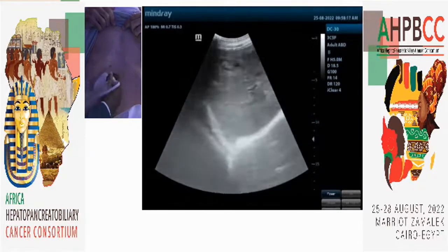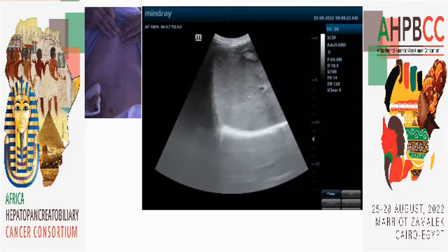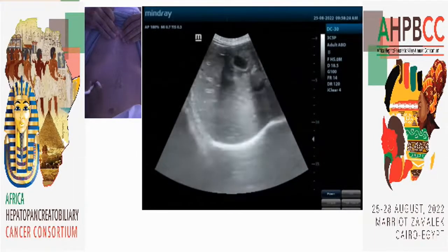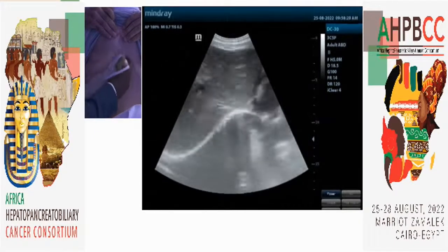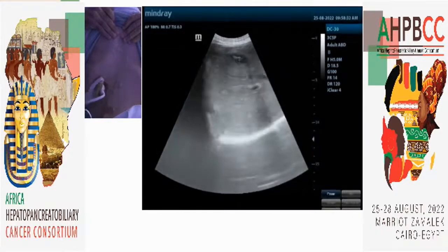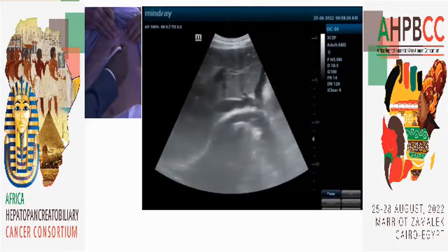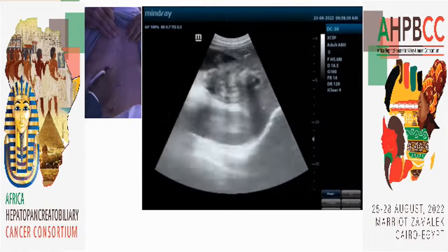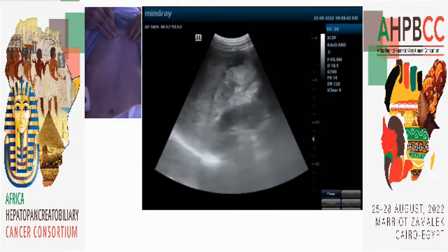So now I'm done with the station 3 assessment, which has so far identified one focal lesion. I am going to go ahead to do the station 4 evaluation. And that is when I'll bring it to this level.